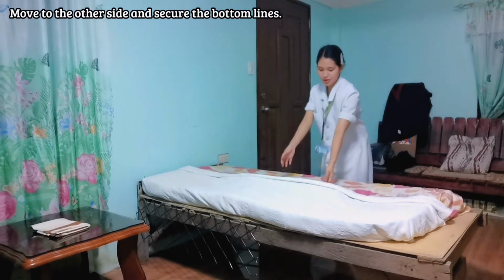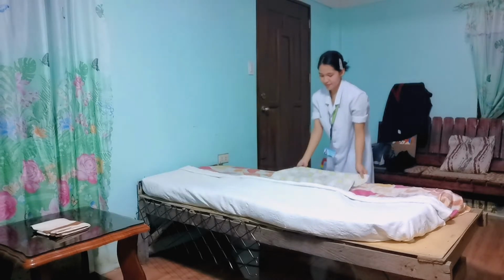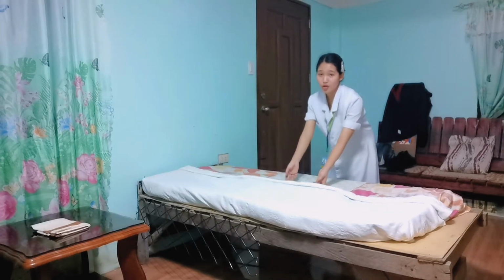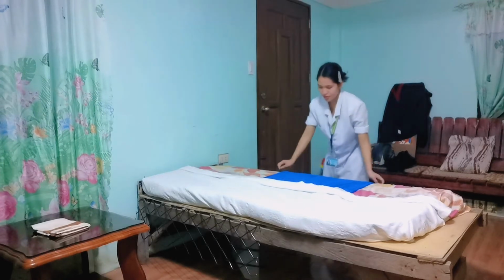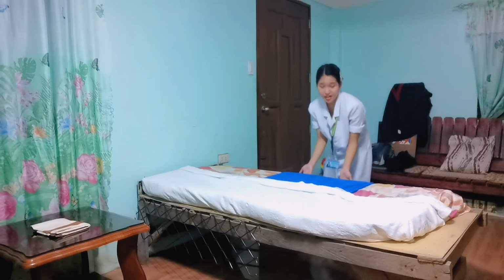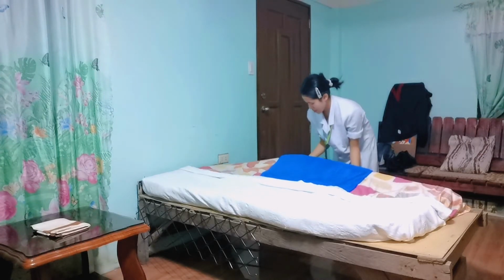And then the second is pull the rubber sheet and also the draw sheet, and tuck them also under the mattress.